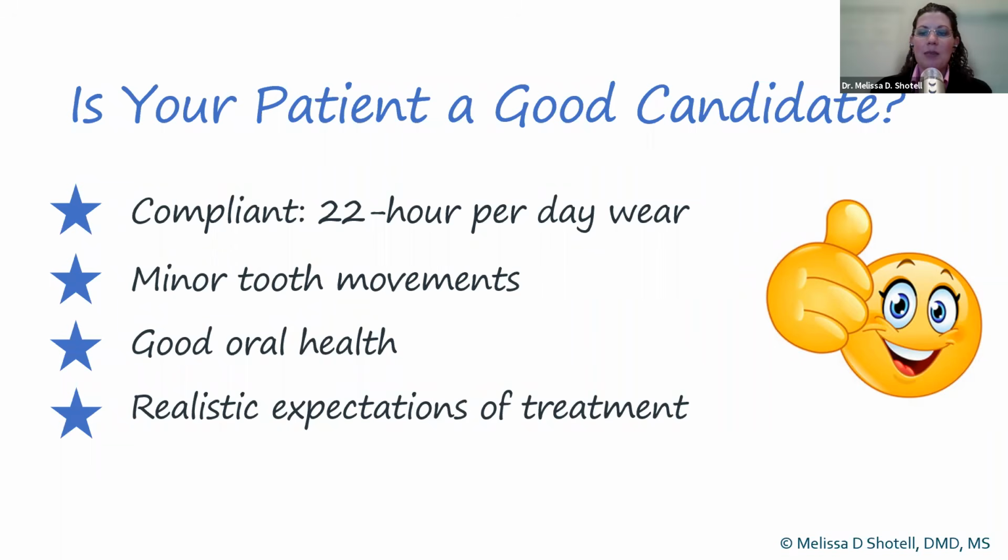Whenever I implement something new, I want to make sure that I'm doing it on a patient that will be extremely compliant so that if treatment does go off track, I'm able to more easily identify, was it patient compliance or was it just a simple complication with the treatment that we just need a refinement or a revision?